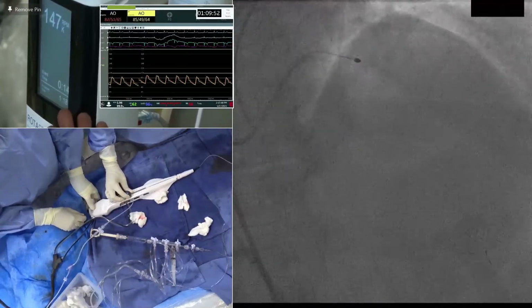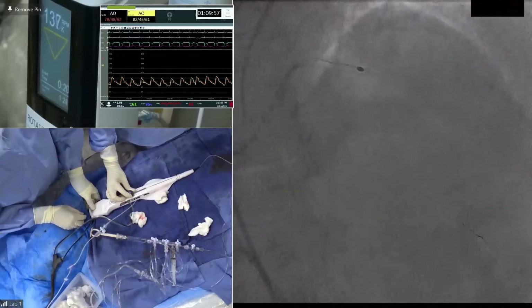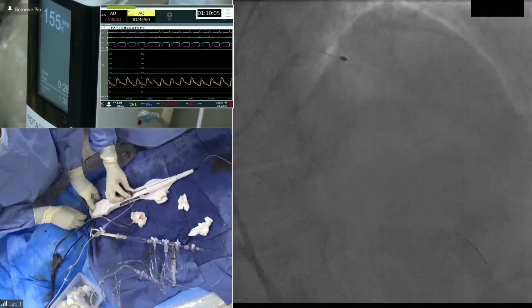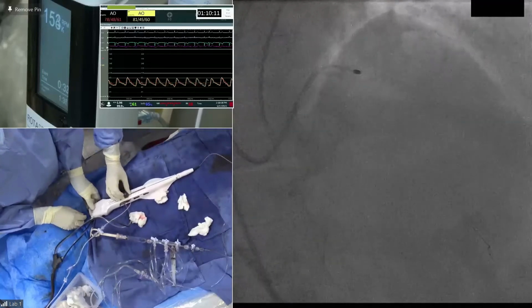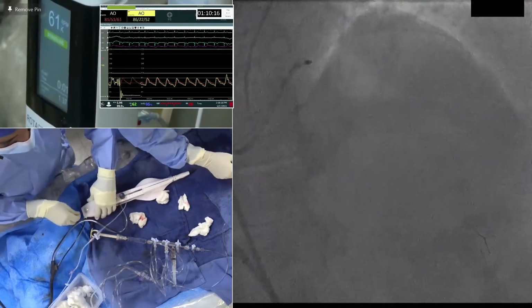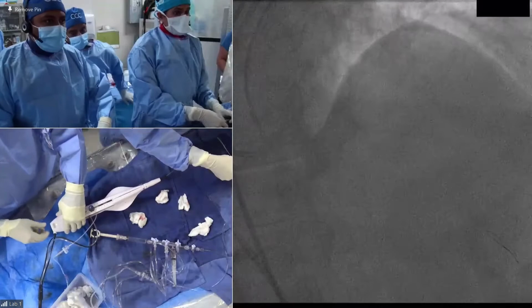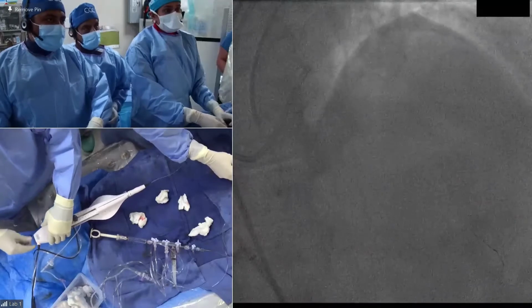Yeah. George, I will say, this new RotaPro system, and this is a good example, I see a lot more decels than the legacy system. You have to go up to higher RPMs. We used to go like 140 safely. Now you have to go at least 160 because there are a lot more decels, for whatever reason. So it decels more if you go 140? Or it decels at 140 but doesn't decel at 160? I'm not sure. You might decel from 160 to 135, but if you go to 140, it might just stall, probably.